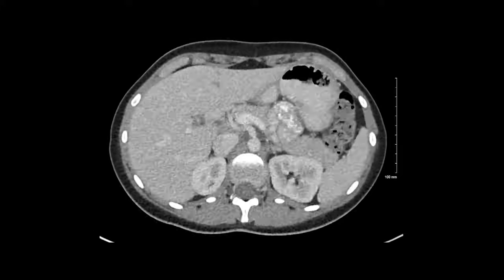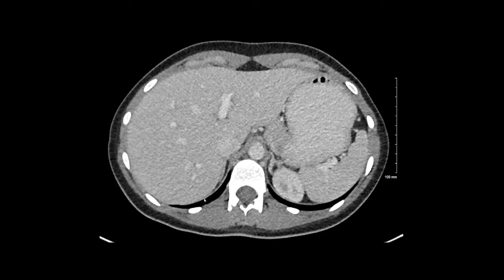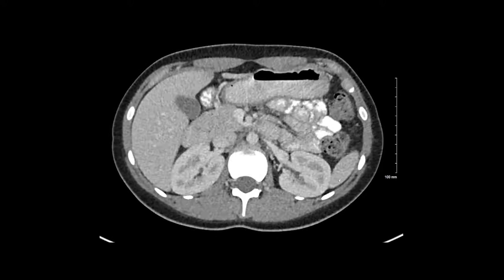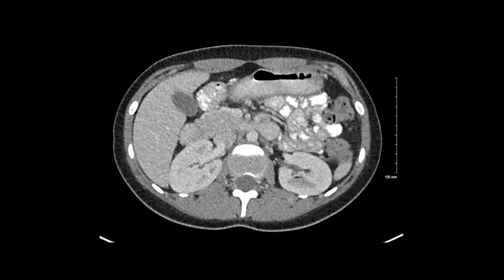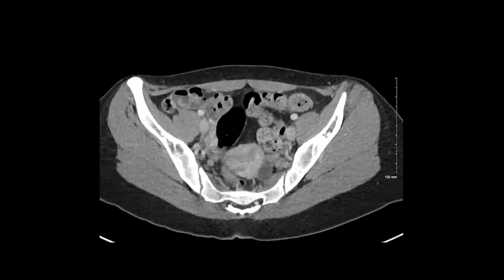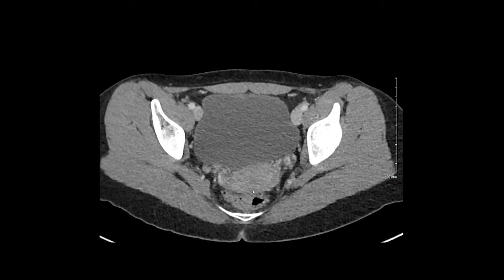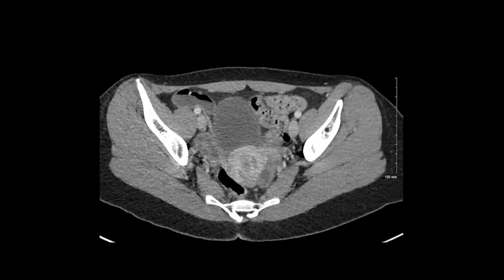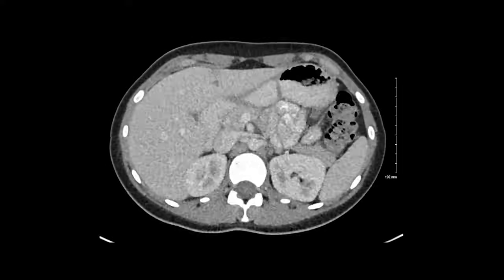Lastly, we're going to look for free fluid. Free fluid likes to settle in dependent locations. In the upper abdomen, we're looking along the interface between the liver and the diaphragm, the interface between the spleen and the diaphragm, the inferior margins of the spleen and liver, Morrison's pouch — a peritoneal recess between the right kidney and the liver — and along the colon in what we call the pericolic gutters. Finally, we're looking at the dependent portions of the pelvis, particularly the recto-uterine pouch in women or the recto-vesicle pouch, which is a deep pelvic peritoneal recess. We don't see any free fluid, so we're feeling pretty good about this case.